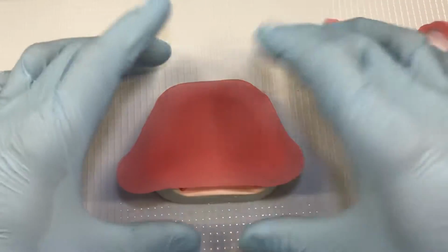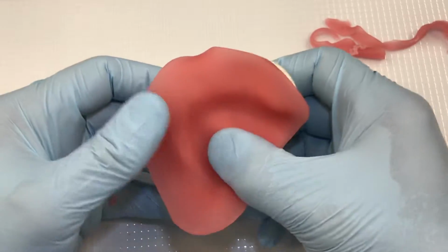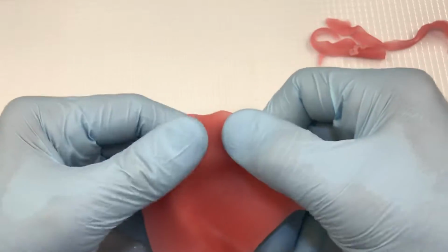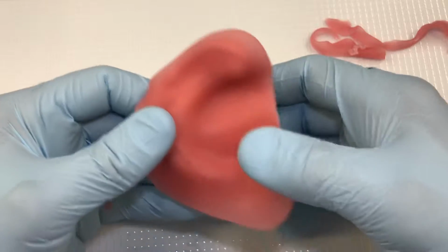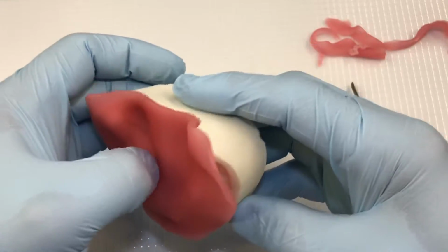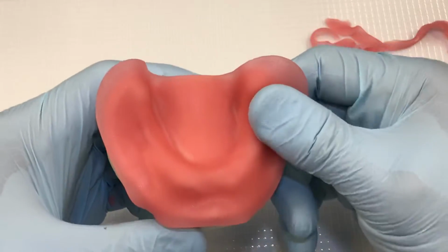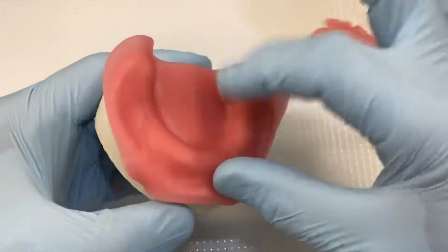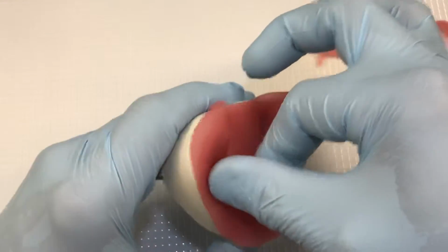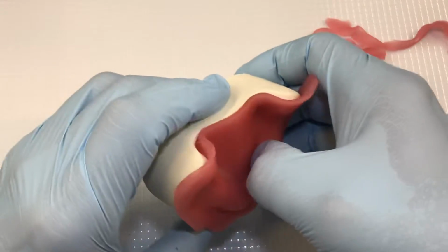So adapting the base plate material for the lower is very much the same technique. You're going to start out from the middle and work your way out. And this time around, I didn't use any pencil lines to indicate where I need to cut it back. I'll use more of a feel with my blade to ensure that I'm all the way to the deepest part of the vestibule.